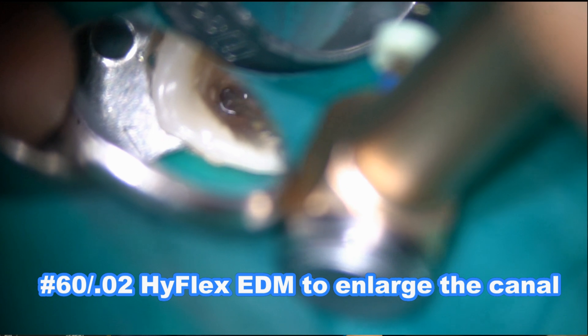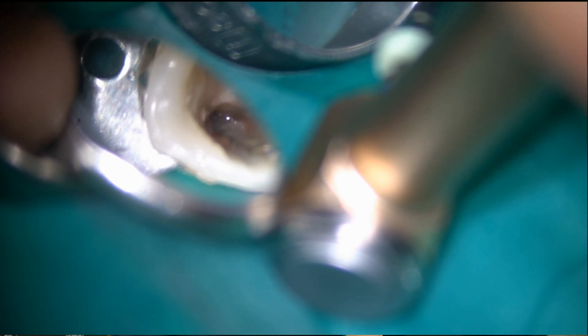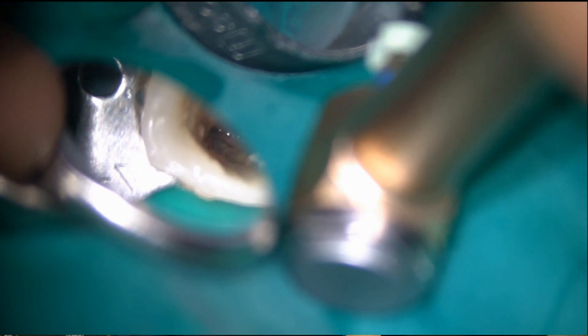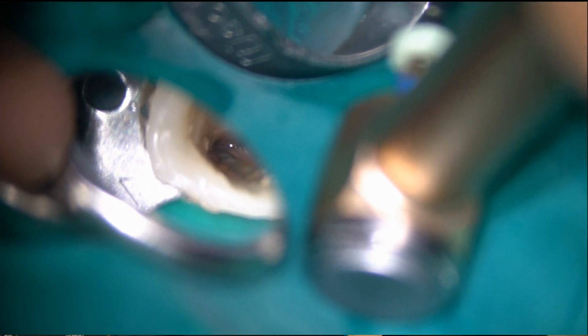The broken instrument is in the mesial root canal. I am using a 60-02 high-flex EDM file to enlarge the canal up to the broken instrument.